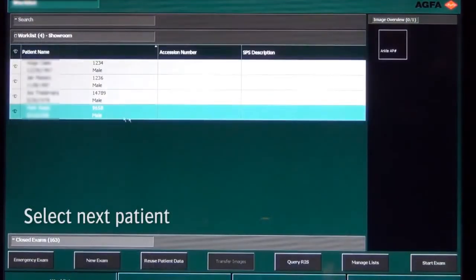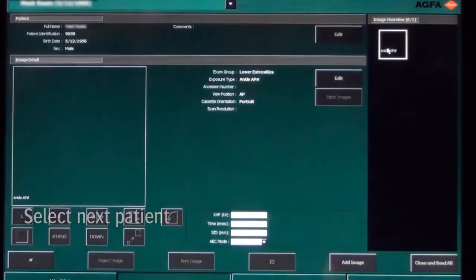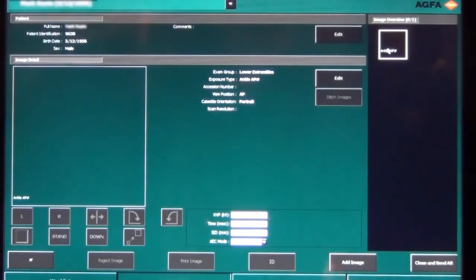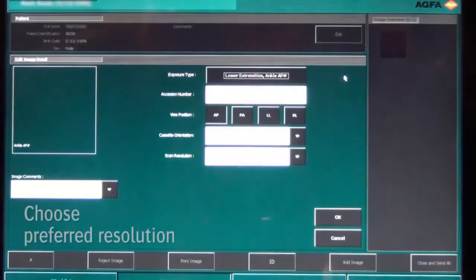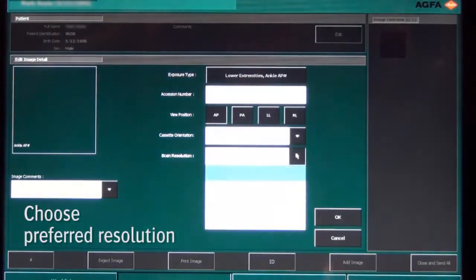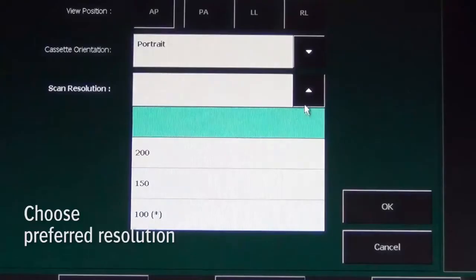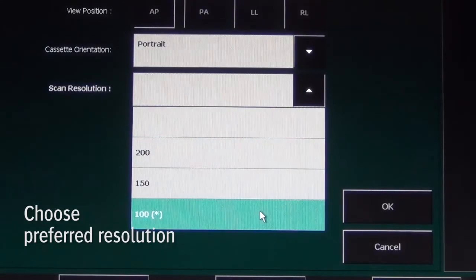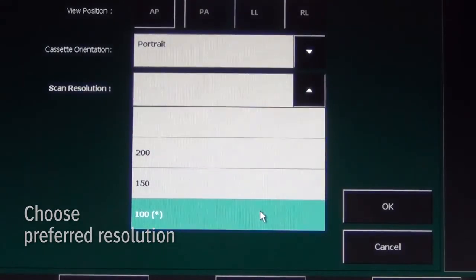Now the next patient is selected in the work list. For this lower extremities examination, the user decides to go for the high resolution of 100 micron.